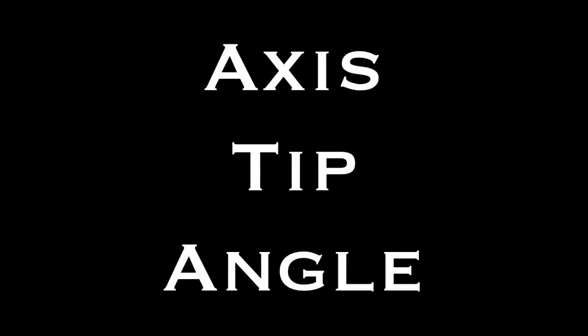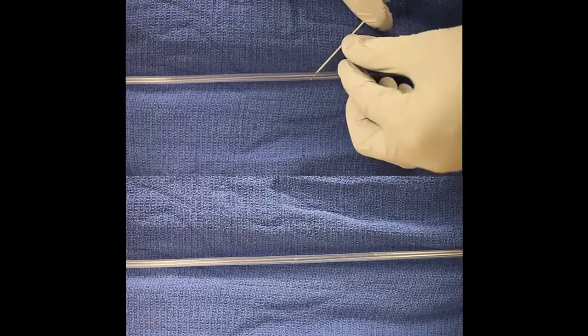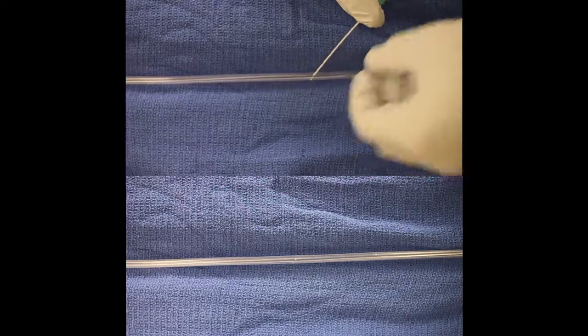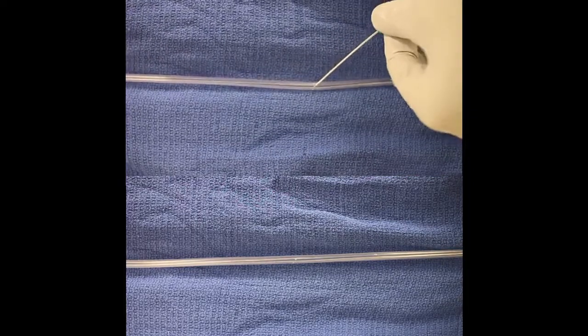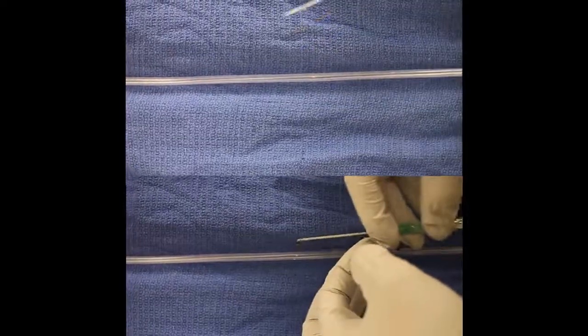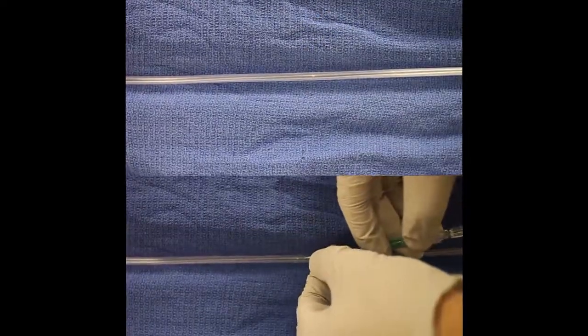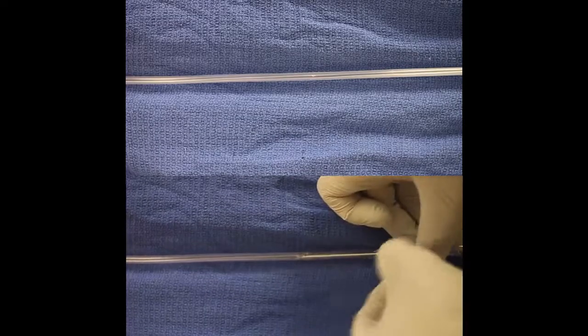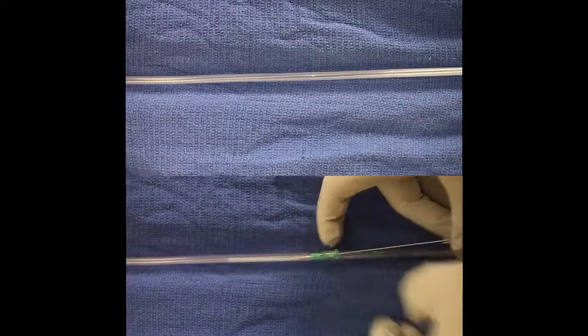There are three things you have to keep in mind when doing this: axis, tip, and angle. Here in this bird's eye view, on the top of the screen I'm at a non-parallel orientation — I'm not at zero degrees with the vein, and when I try to advance the catheter, I can't, or in real life you'd probably go through the vein. On the bottom part of the screen, when I go in with the needle, I'm going at zero degrees, completely parallel, so sliding the catheter in is much easier.